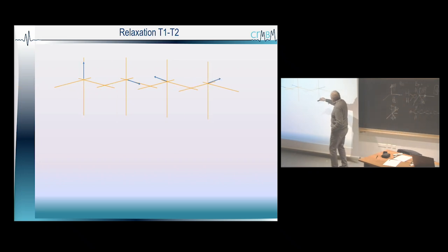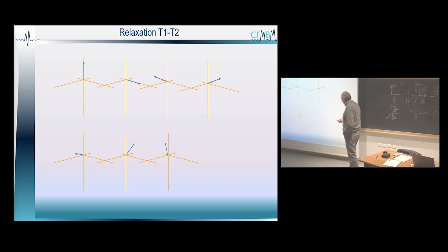It goes like this, so negative value, then positive value, but a little bit up, and then you're going to continue, negative value, but smaller, and then positive value, a little bit smaller, and again, until you go back to here. And what you are going to measure is actually this. You are going to measure the phase and the intensity of this signal over time, and this is the NMR signal. Let's have a look.